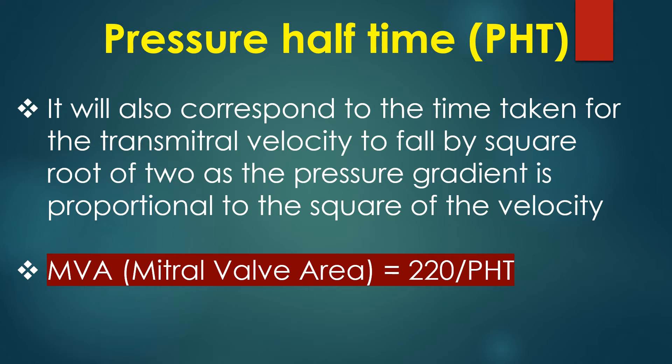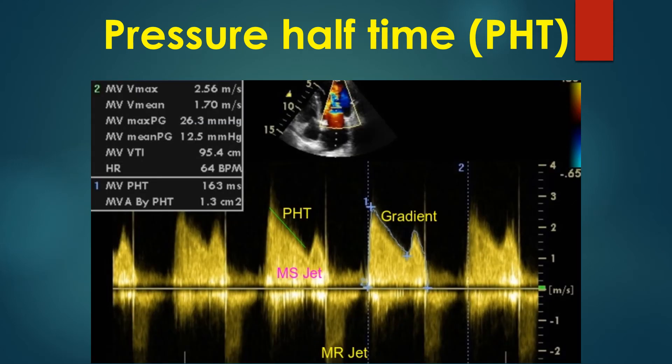Mitral valve area is equal to 220 divided by pressure half-time. In this image, the green cursor measures the pressure half-time of the mitral stenosis jet. In this case, the pressure half-time was 163 ms and the estimated mitral valve area by pressure half-time was 1.3 cm².